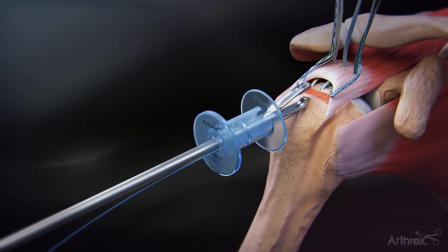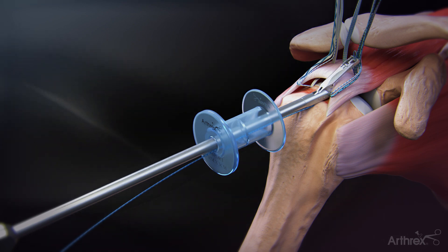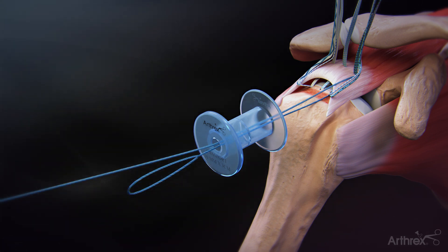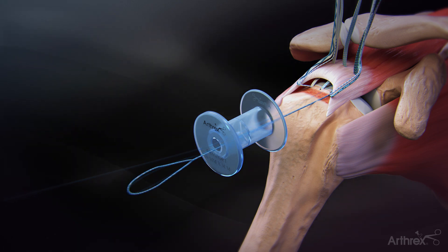Once the fiber tape sutures are passed through the tendon, load the single end of a fiber link suture into the scorpion suture passer and pass the fiber link suture through the tendon lateral and outside to the fiber tape pass. Using a suture retriever, retrieve the tail of the fiber link suture through the anchor insertion portal to improve the shuttling angle.